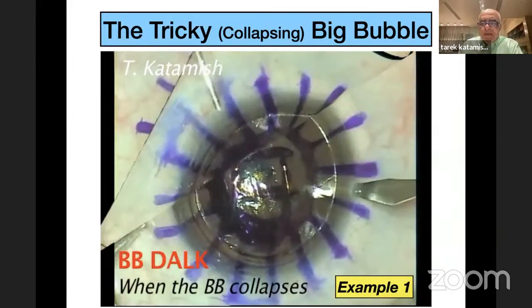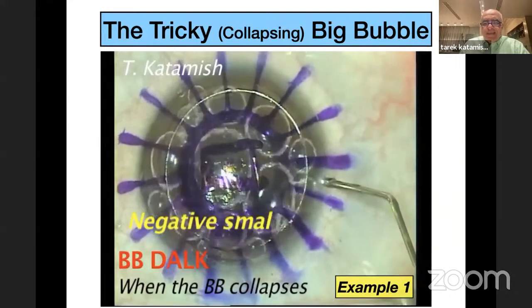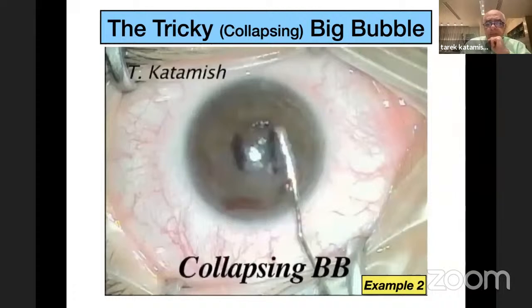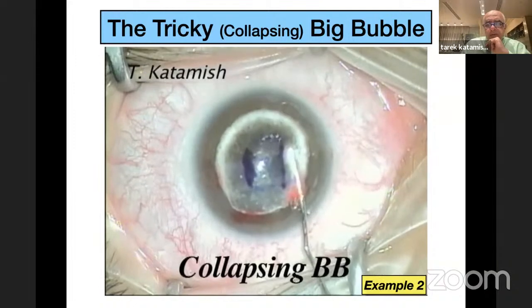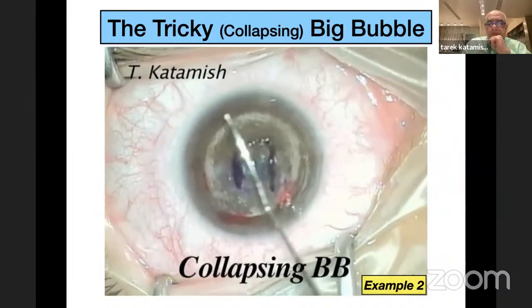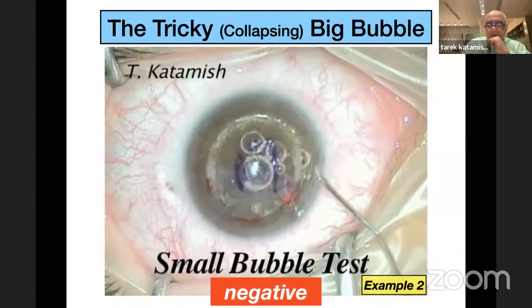No air inside anyway. So the proof is when you do the small bubble test, it is negative. It's supposed to be positive because we have a big bubble, but the bubble has escaped. I call this tricky situation the collapsing big bubble. Another example, you see injecting, having a big bubble, and when you are going out, you see the air is coming out with you. And when you do the small bubble test, you will be astonished. It is negative because the bubble has collapsed, you see?